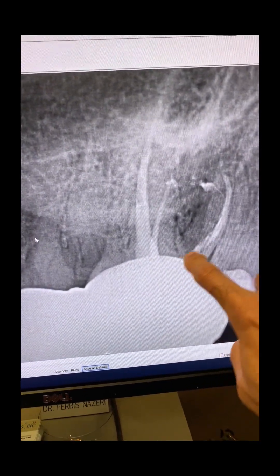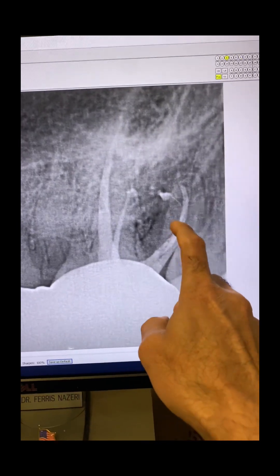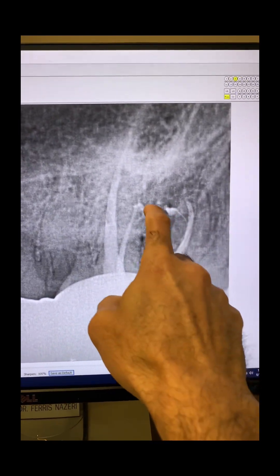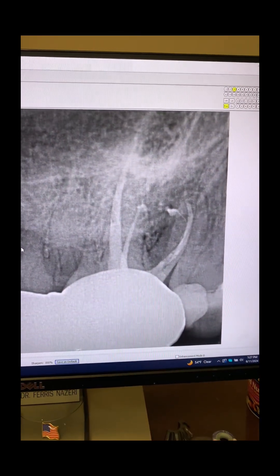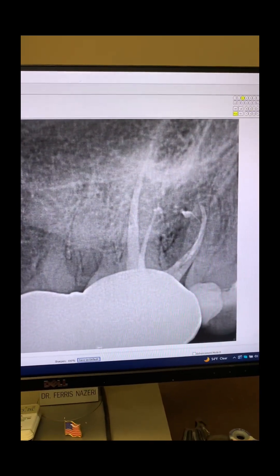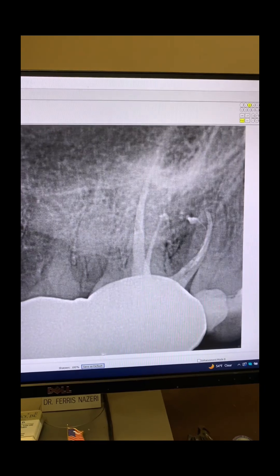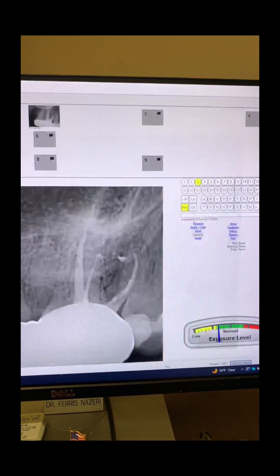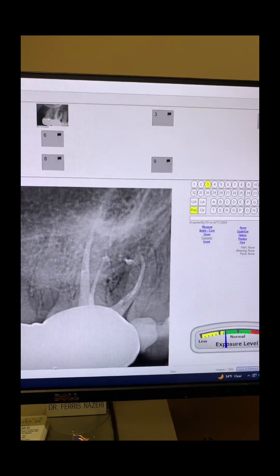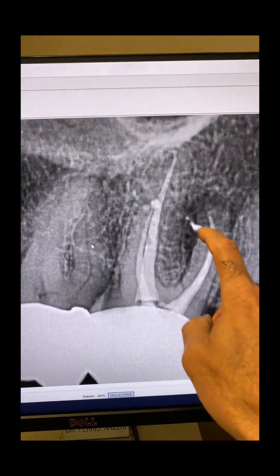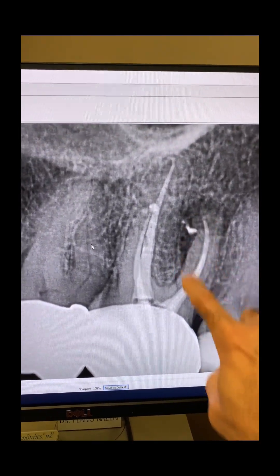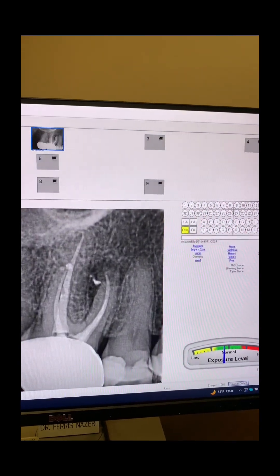Take a look here — you can see the missed MB2 that we were able to locate. And look at that beautiful anatomy: the beautiful lateral canal that we were able to capture right into the lesion. The missed MB2 was due to the very limited ninja access that the endodontist had made going through the crown. Here is another angulation showing that beautiful lateral right into the lesion.